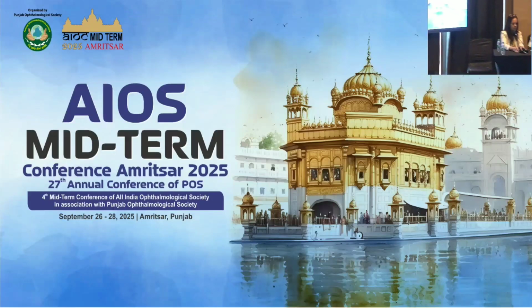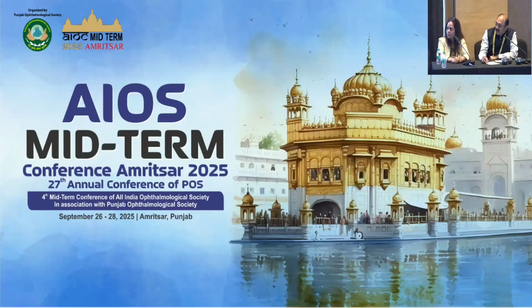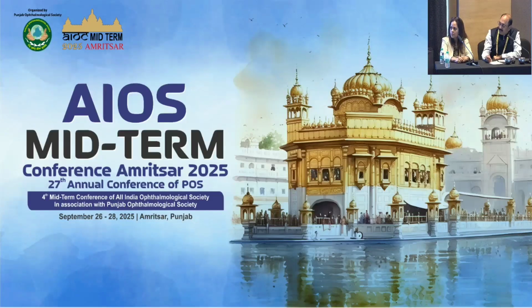So, Mr. Kunal, do you store all the data in the cloud or on the hospital servers? We give both options to the hospital. If they want on-premises, we give the on-premises one. If they want the cloud, we do it both ways.